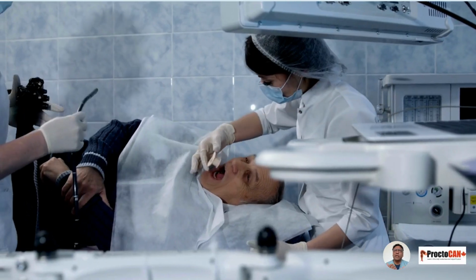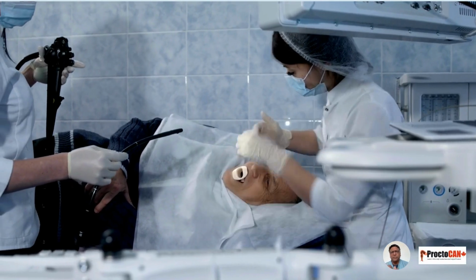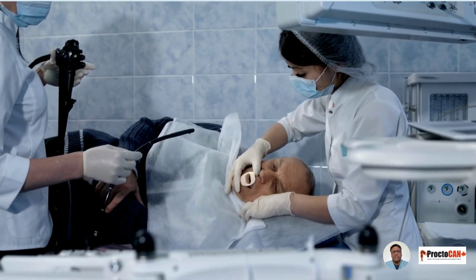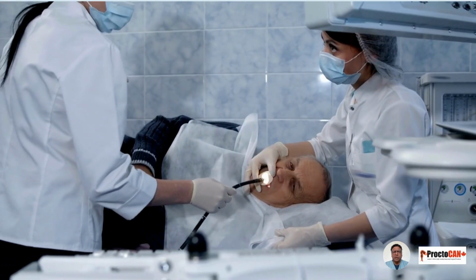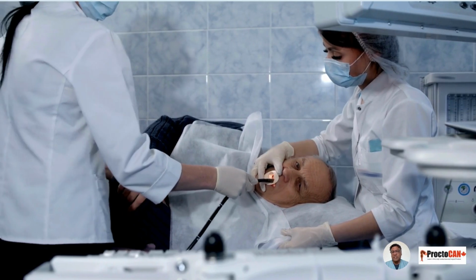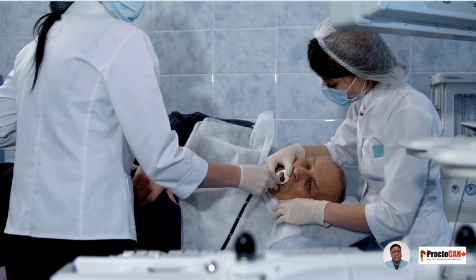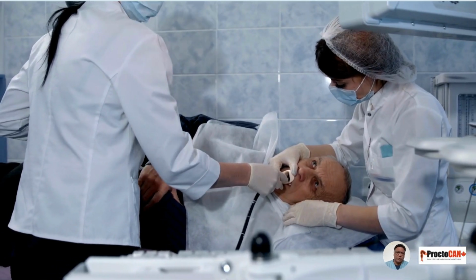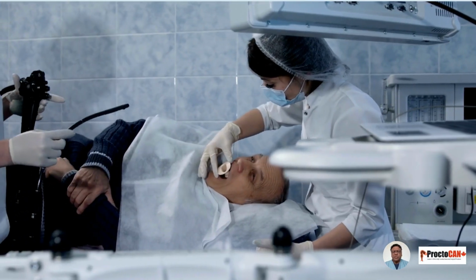When you arrive for your gastroscopy, we'll start by inserting a small plastic tube into your vein where we will inject the anesthesia later. Then we will attach oxygen and blood pressure monitors to your arm and fingertips to track your vital signs. You'll also receive oxygen through a tube placed just inside your nose. A plastic mouthguard will be placed between your teeth to protect them and to help guide the endoscope.